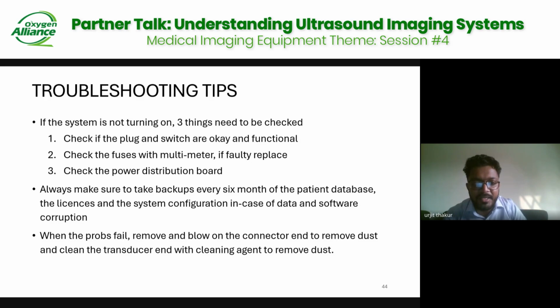And finally, another thing is when the probe fails, you can remove the probe, blow on the connector end and remove the dust. Generally, this helps sometimes. Clean the transducer end with the cleaning agent to remove the dust. Reconnect it, restart the system, reconnect it, and then the probe generally starts functioning. This works most of the time.